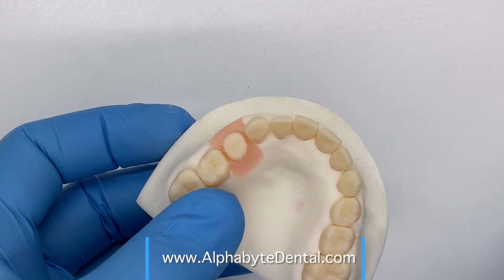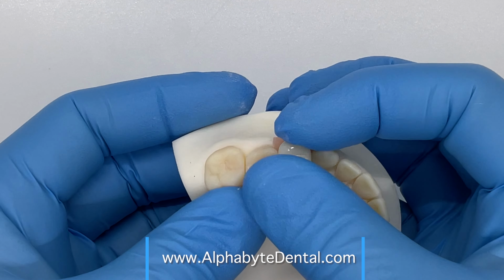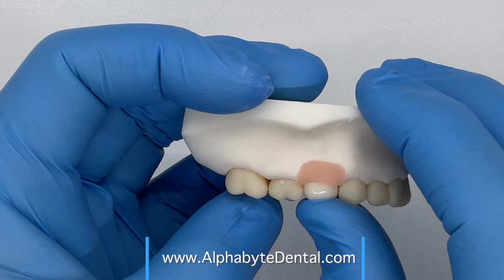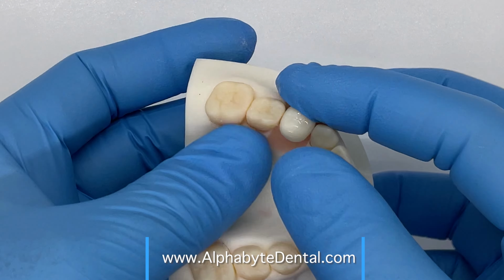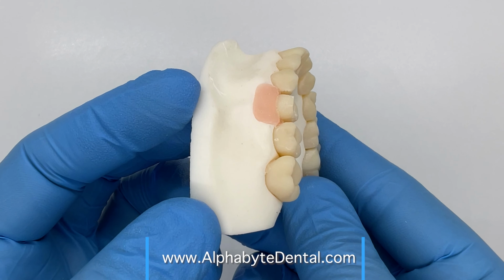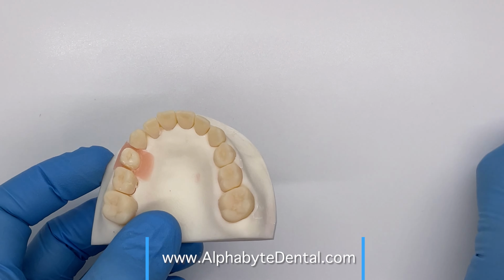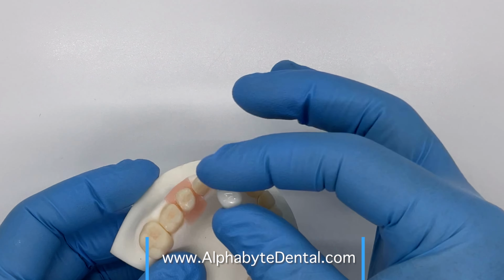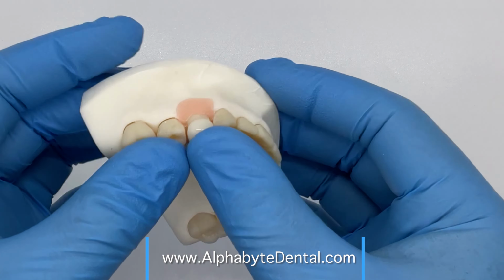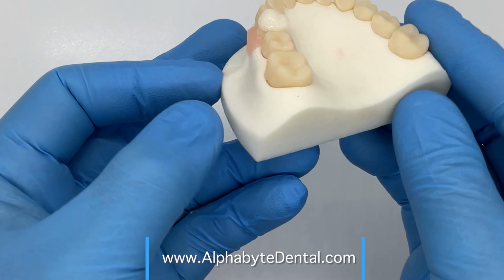And by looking at the color mapping and the cheat sheet for preparation, perhaps we can nail this preparation the first time, and that pre-selected crown fits perfectly on the first attempt. And now perhaps we have accomplished a pediatric zirconia crown faster than we ever could a stainless steel. But more often than not, especially as you begin this process, you're likely to leave an area of under-reduction, and exactly what is causing this crown to bind and not fully seat is a completely subjective situation, usually something corrected by experience alone.